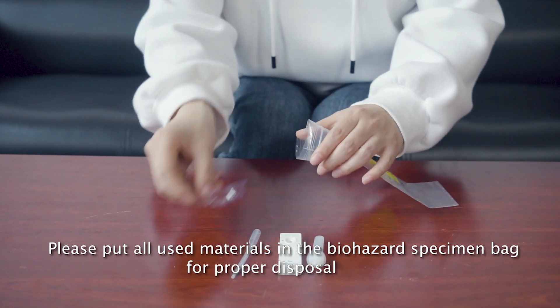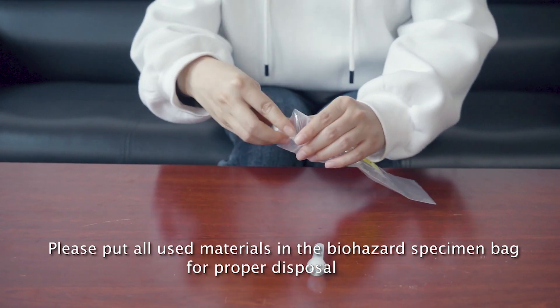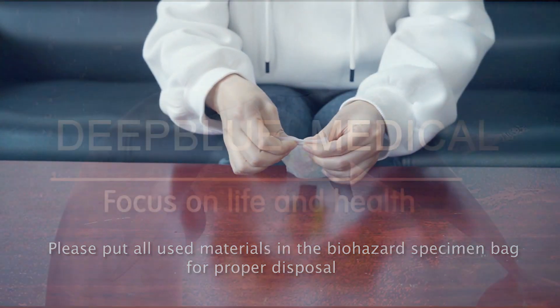Please put all used materials in the biohazard specimen bag for proper disposal.